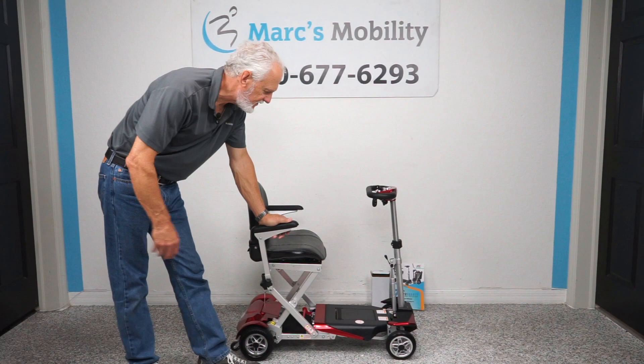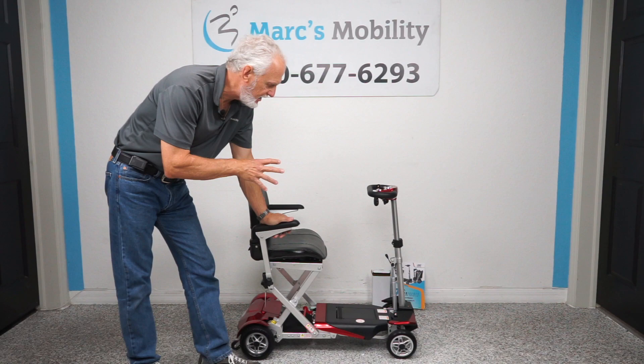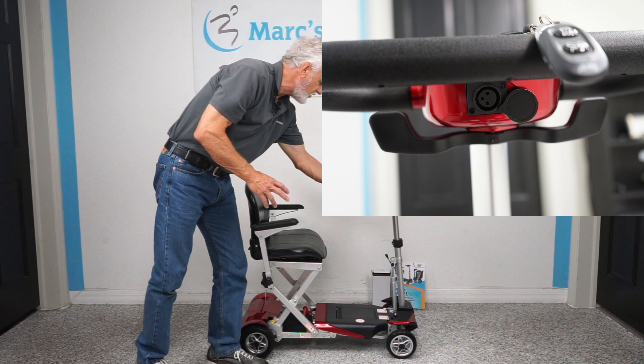Hi folks, this is the new Transformer by Enhanced Mobility. This is the original one that's been around forever — it's been redone and reshaped a little bit. It still has a 300 pound capability, but you can see the wheels are a little shinier, the frame is aluminum now, it just looks a little better aesthetically. You can now charge it from the front right here instead of having to go from the back.